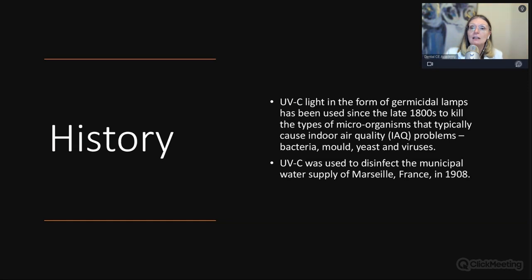And UVC light in the form of germicidal lamps has been used since the late 1800s, actually, to kill many types of microbes that typically cause indoor air quality problems. Bacteria, mold, yeast, viruses. Tuberculosis was a huge, huge problem, and we'll see it was actually used for that purpose too. So UVC was actually used to disinfect the municipal water supply of Marseille, France in 1908.